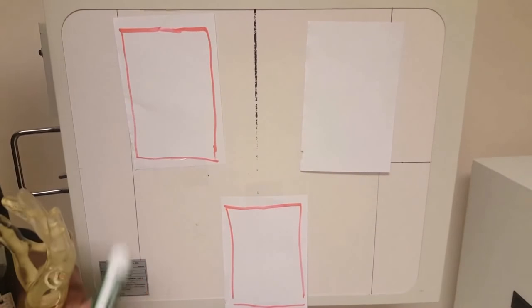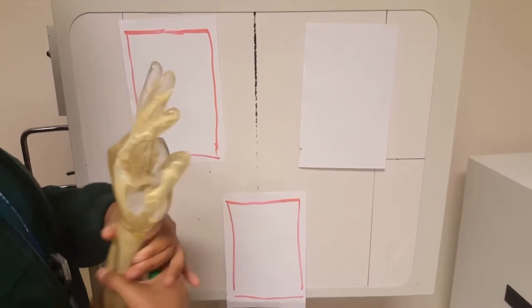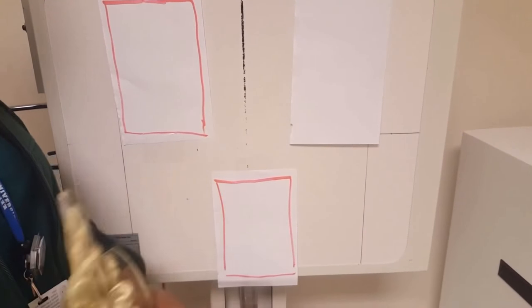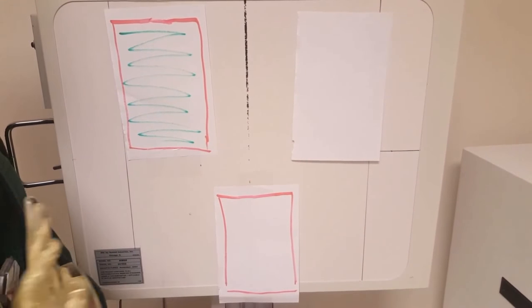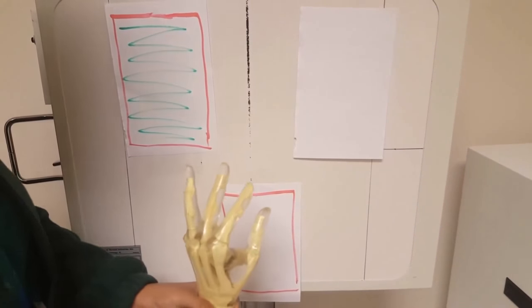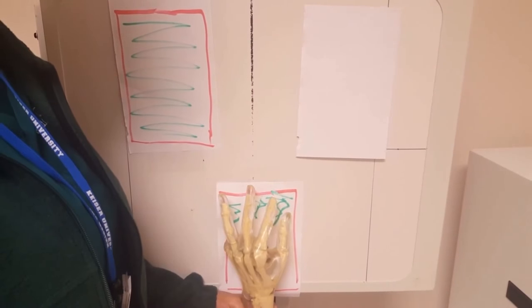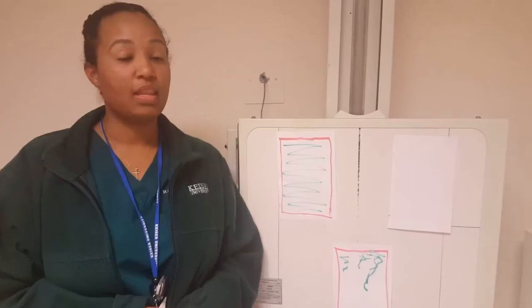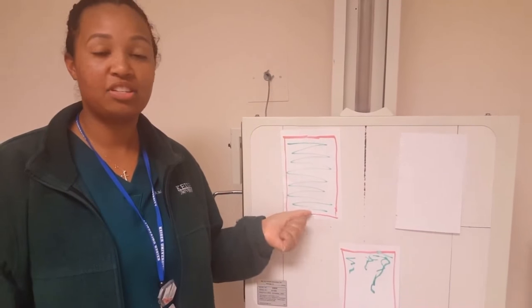When choosing the combination that you want to use to create an image, the selection is important because if the body part is not covering the chamber completely, or leaving one of the chambers out that you've selected, radiation can proceed to the chamber and set off the alarm prematurely, and the patient has to be re-exposed again. If the patient is not covering the chamber completely, like in this example, radiation can seep through the body part, terminating the procedure prematurely, meaning that the patient will have to be exposed once again. If the body part cannot cover the selected detectors completely, then the AEC chamber should not be used.